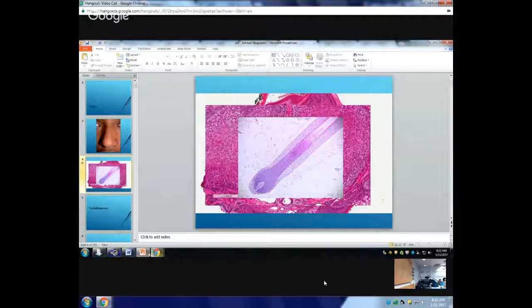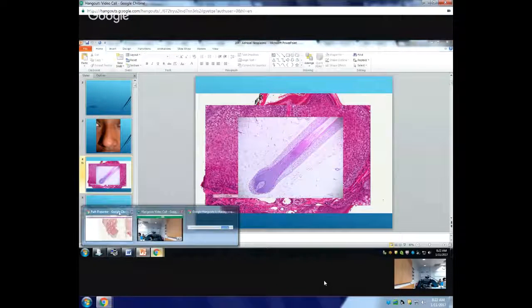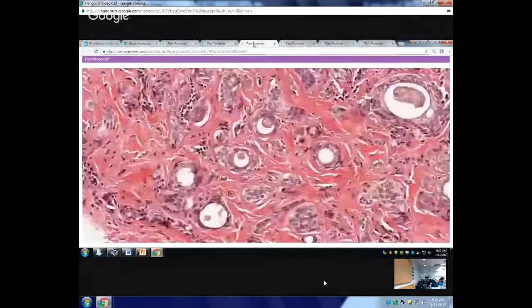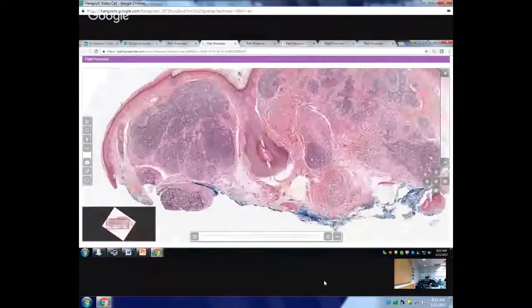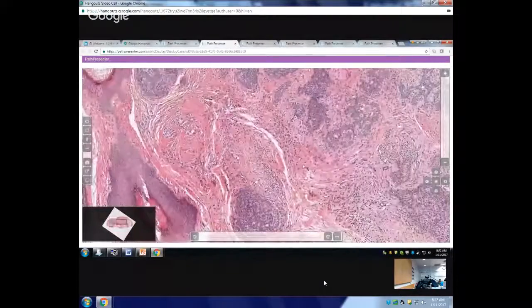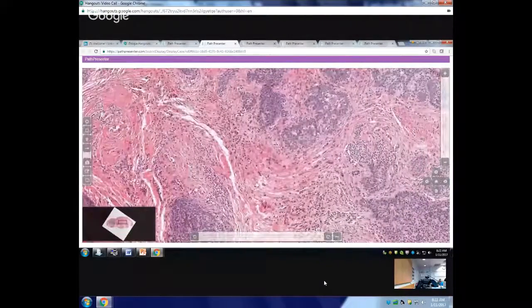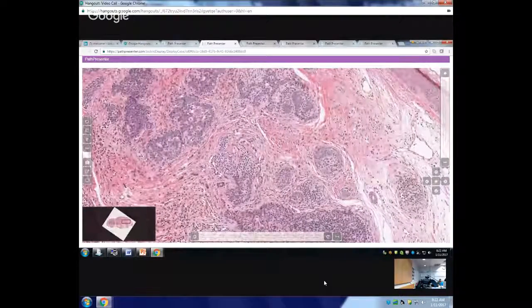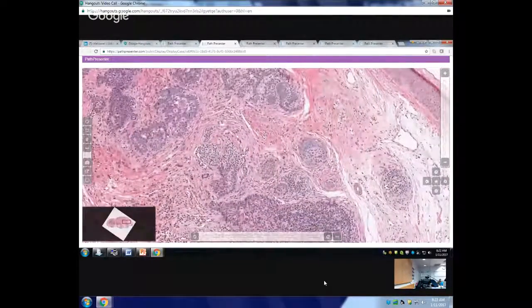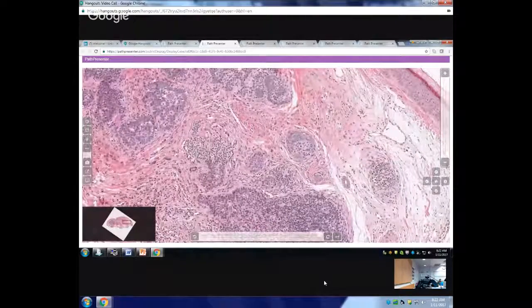That will tell you that this is arising from the hair follicle. Here, this is the lower part of the hair bulb, and this is the dermal papillae going within the hair bulb actually. You can see, does this look like the lower part of the hair follicle?